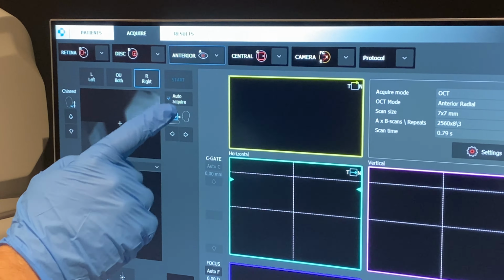This is the scanning area window, which you don't normally move, but for example, if you had a central cataract, you could try scanning above it, below it, or around it. And then the middle cross is the fixation. So if you're doing semi-auto scans, you can move the fixation yourself. But for disc scans, it will automatically move the fixation for the patient to rotate the eye.